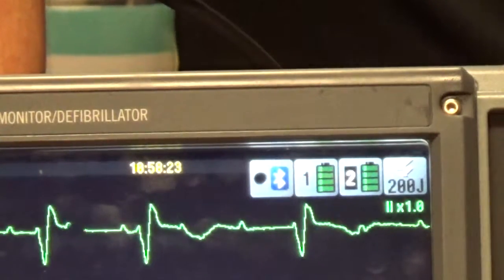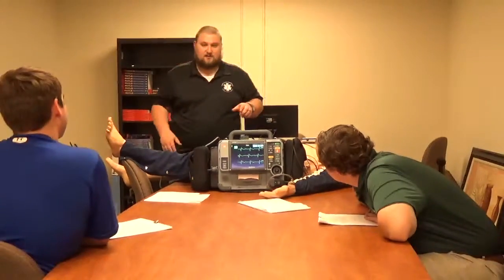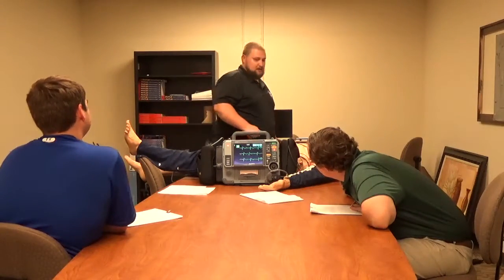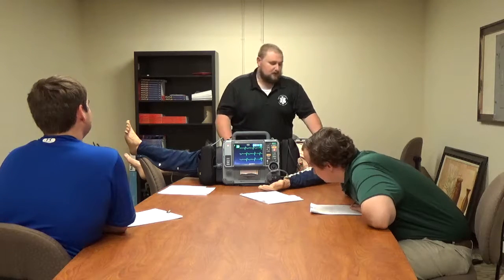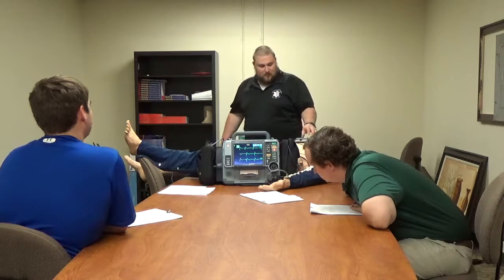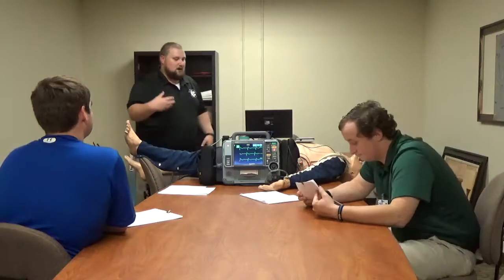Okay? So, which one is a constant PR interval but drops an occasional beat? Second degree type 2. Which one is a constant widened PR interval? First degree. Which one is a complete dissociation between atria and ventricles? Third degree. All right. The PowerPoints that I give you, every bit of that goes along with this. What I've done was kind of a cut down version of it, but the PowerPoints go a little bit more into detail.